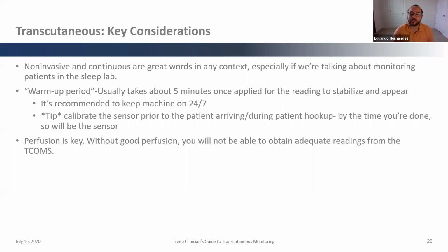There's many methods of how you do it versus what monitor, that kind of thing. I'm not going to get into that too much, but doing that when the patient comes in is a kind of a good tip and trick. That way, or once you're setting up the patient, you could also calibrate that. That way it's ready for you to record up to 12 hours during the study.